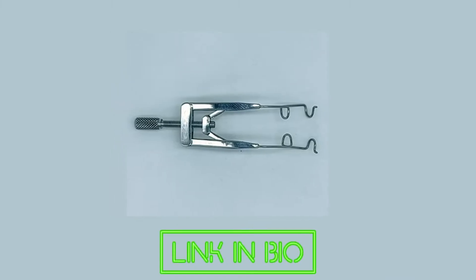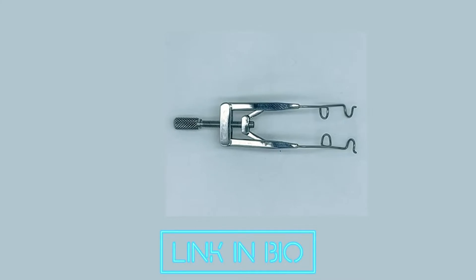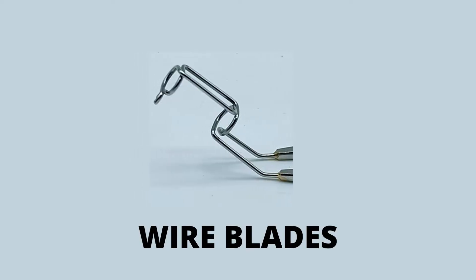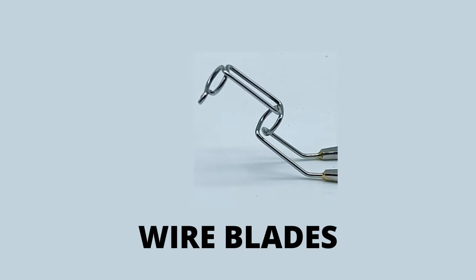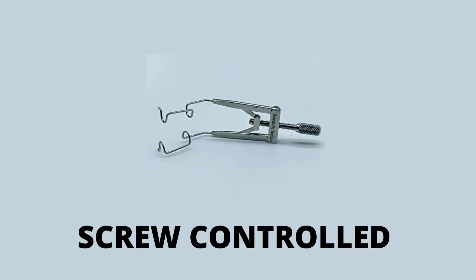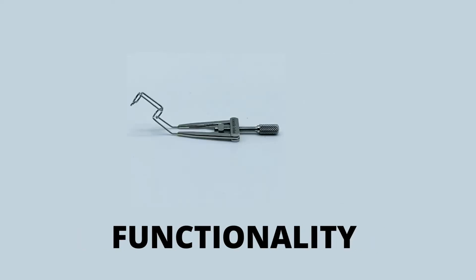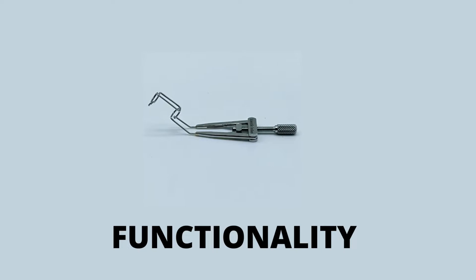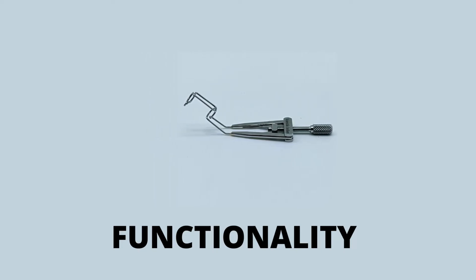Lieberman Eye Speculum offers a more controlled opening of the eye during surgery. These have wired blades that help in the retraction of eyelids without undue pressure. It has a screw mechanism that offers better control in opening the eye speculum during surgery. It also has an angle blade that reduces the interruption of the operating eye field during surgery.